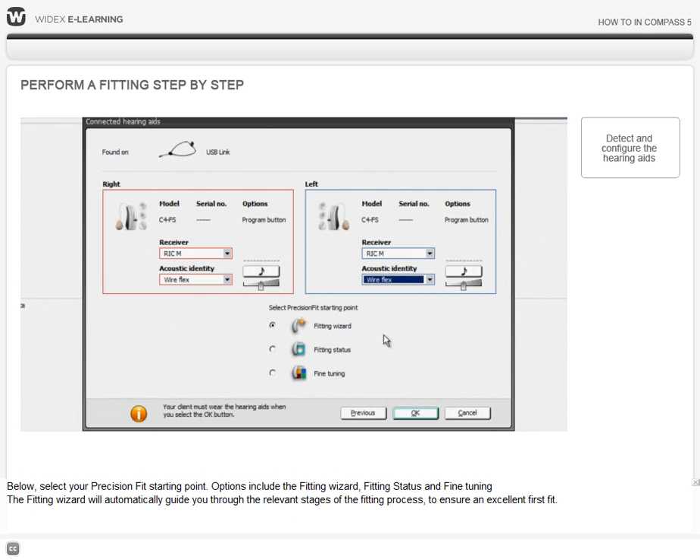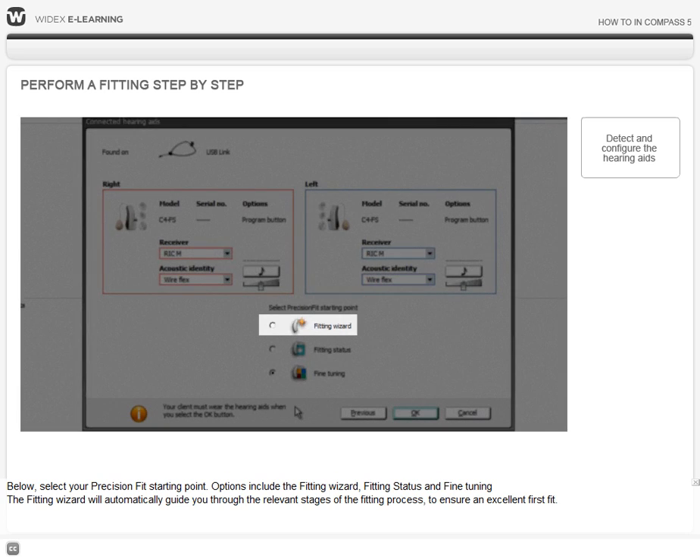Below, select your Precision Fit starting point. Options include the Fitting Wizard, Fitting Status, and Fine Tuning. The Fitting Wizard will automatically guide you through the relevant stages of the fitting process to ensure an excellent first fit.